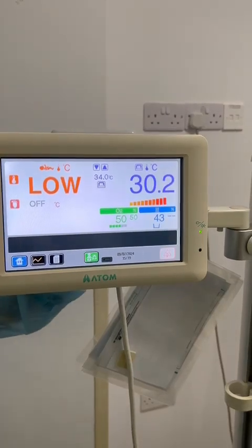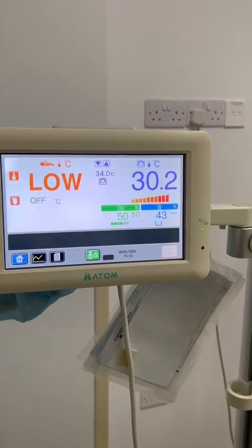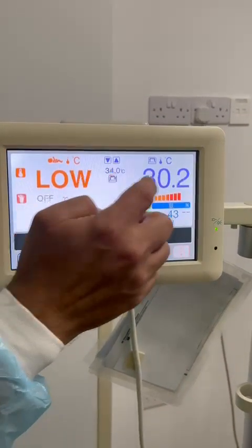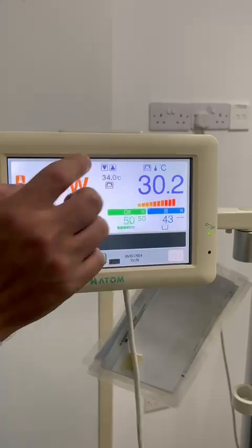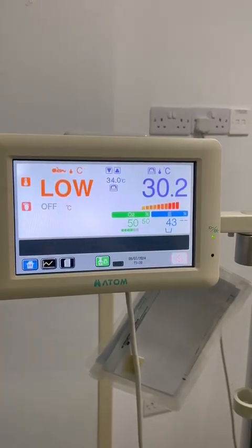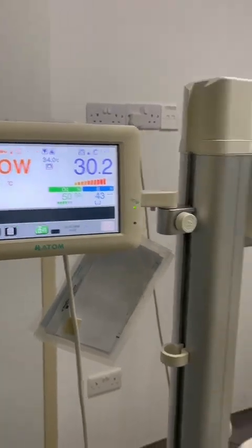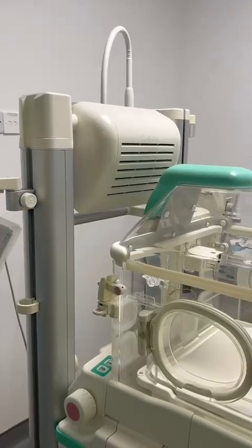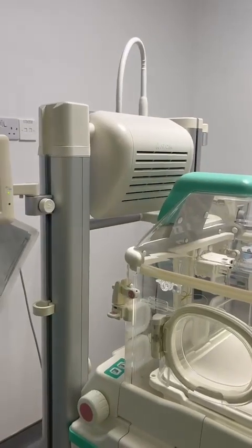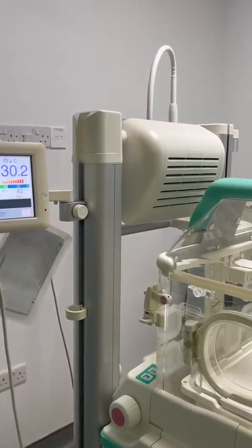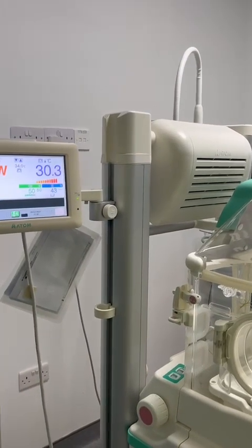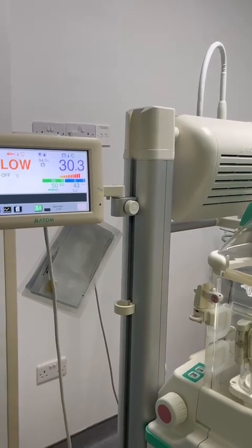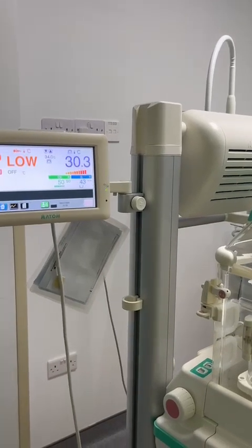Step by step, the temperature will start increasing until these two values are matching. This way we have selected the incubator air temperature, and the function of the incubator is to achieve and maintain this 34 degrees of air temperature.